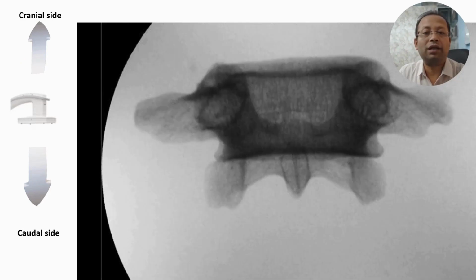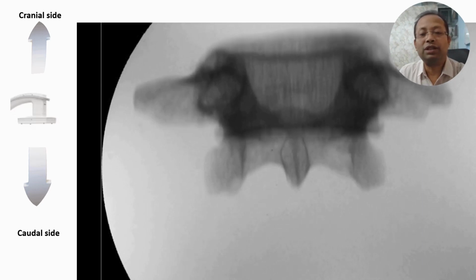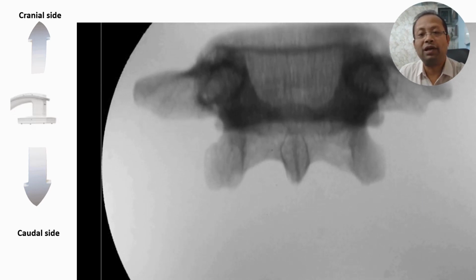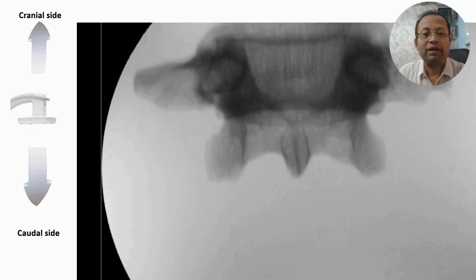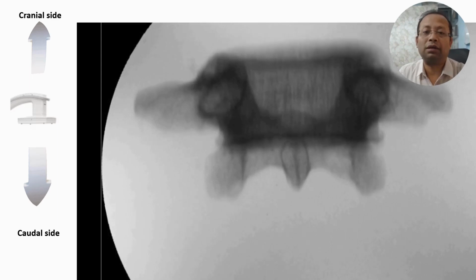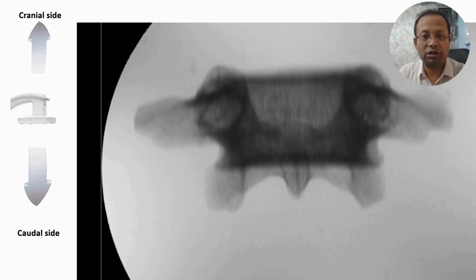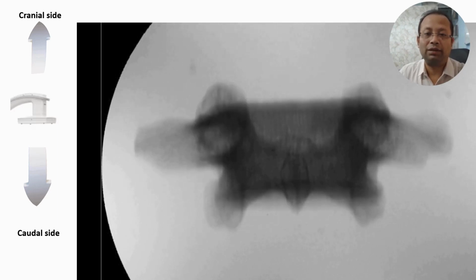Now the same thing you can see with the C-arm. So here you see the lower end plate which is becoming oval gradually, and then with the opposite movement it will cross the position of a straight line and again it will become oval.